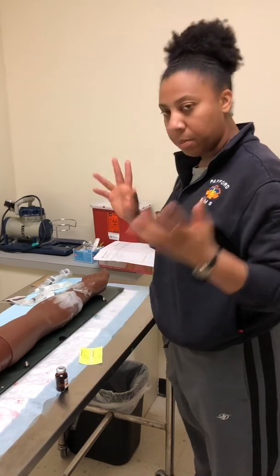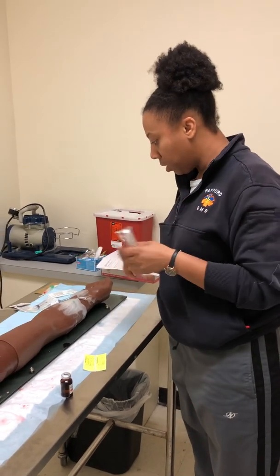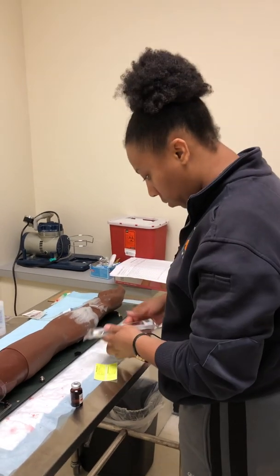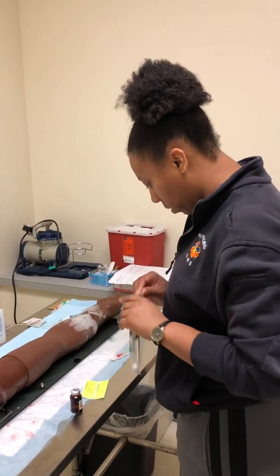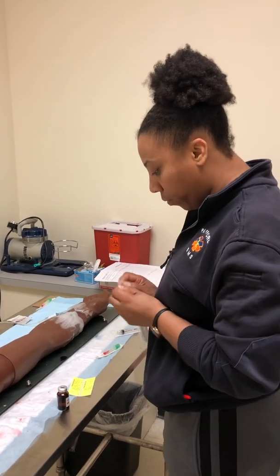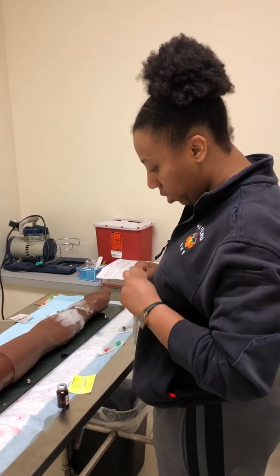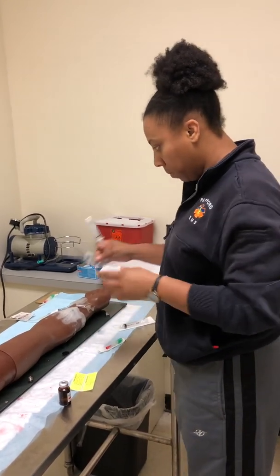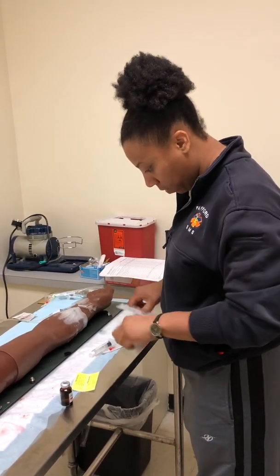I will go ahead and get my medication together. So, like I said, we're going to be giving 4 milliliters. So I need to draw up 4 milliliters of Lasix. Okay.